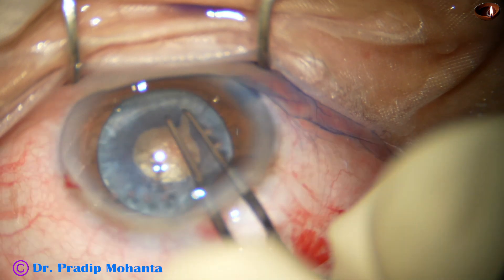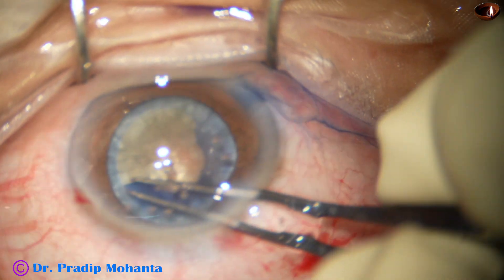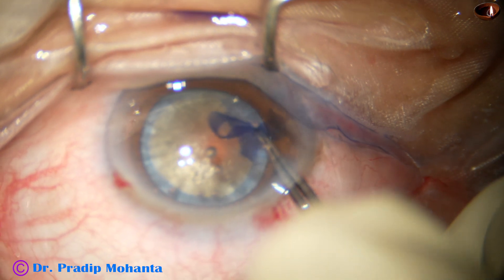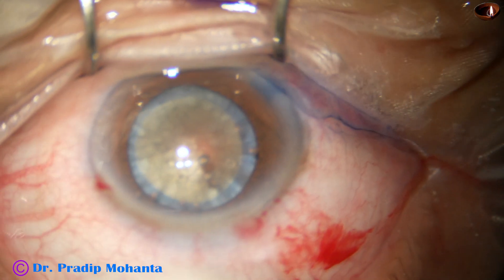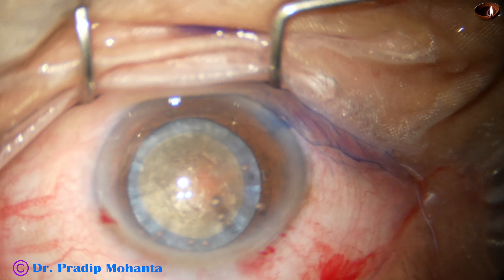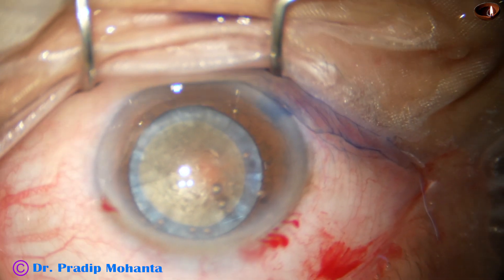Use the utretor forceps again to convert this small rhexis into an optimum-sized rhexis. Dear colleagues, we must learn to use the utretor forceps, particularly in this kind of intumescent cataracts. It is very difficult to manage such cases with a 26-gauge bent needle cystitome.